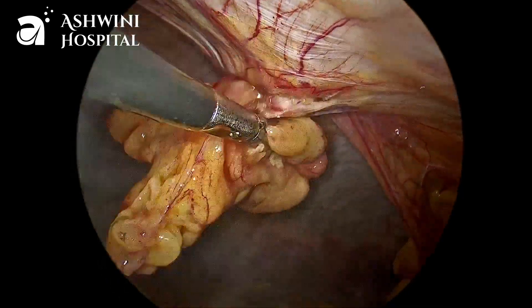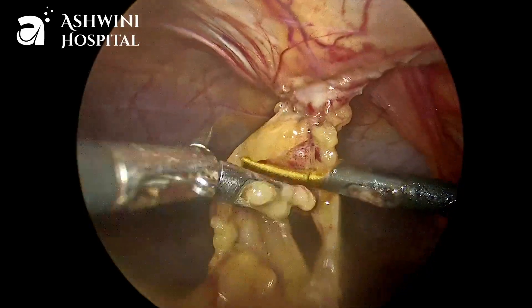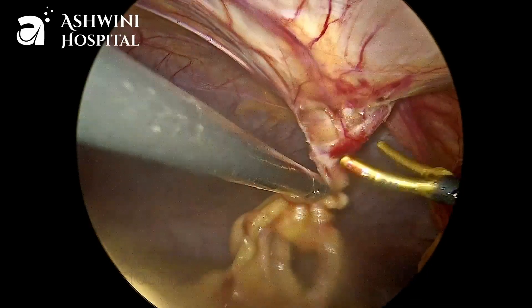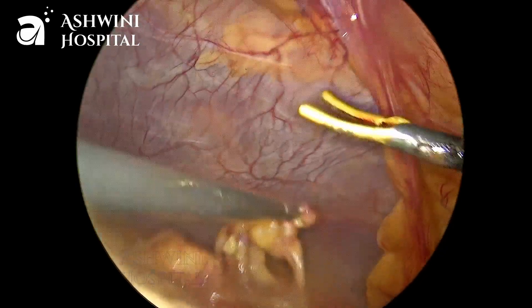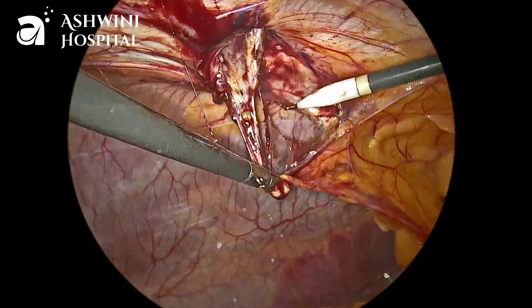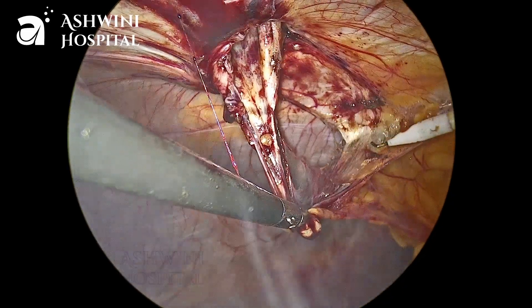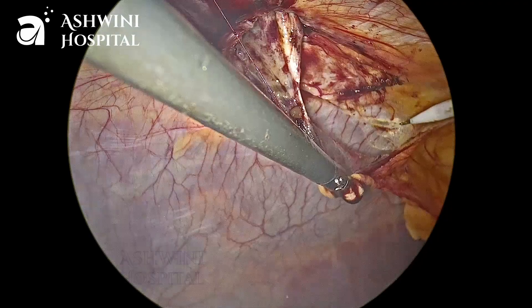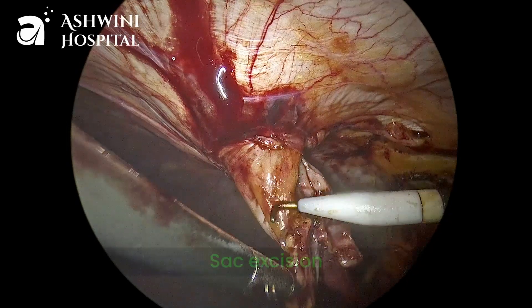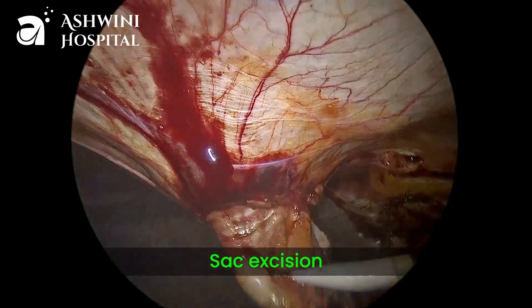We should make sure we do not leave any content in the sac, or else in the postoperative period seroma formation will occur. The fat and falciform ligament are released from the parietal wall by using monopolar hook. This step helps in proper approximation and integration of the mesh to the parietal wall.